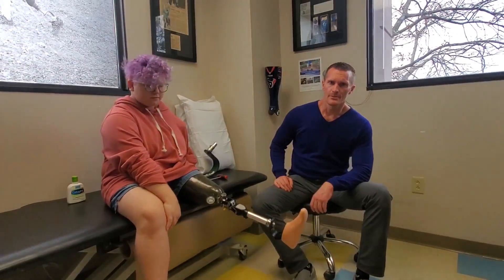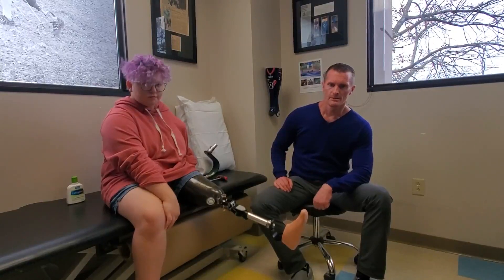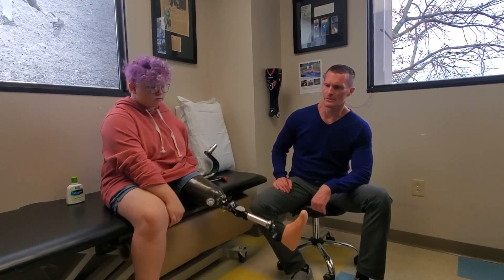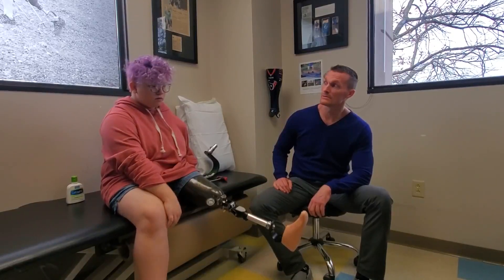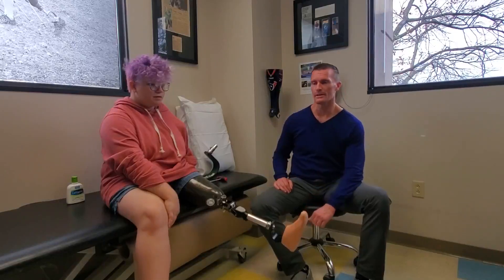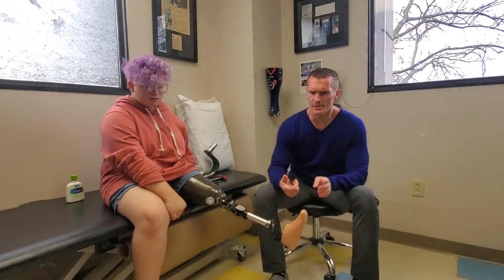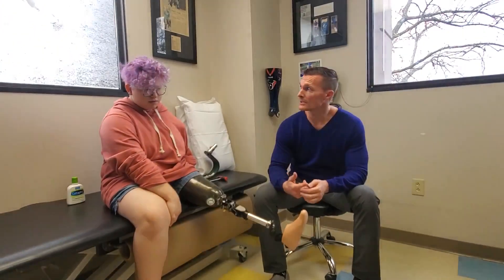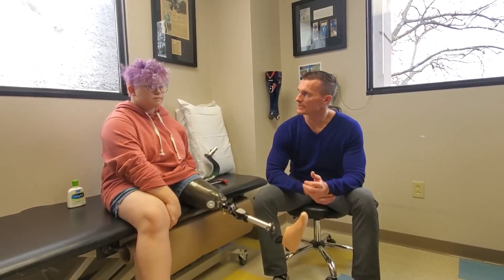Okay, so this is Erin. We're doing a summary of a video for SkinFit. I was talking with your parents — do you remember how old you were when we started? I think I was about nine. I thought eight or nine. So we've known each other a long time. We've never done one of these videos with you, correct? We're doing this to keep up with what we do with so many different kids and take them for case studies.